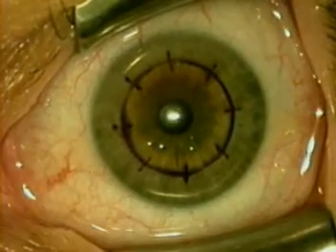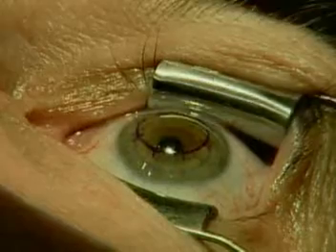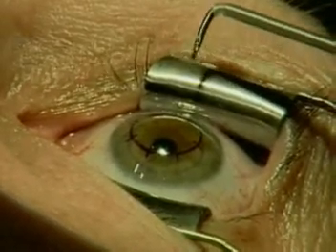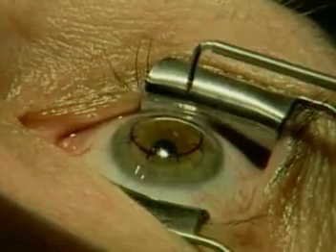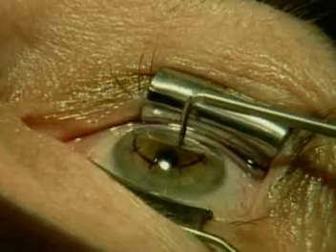The outer hash mark is at eight millimeters. We make sure that the hydration of the cornea is uniform — that's why you saw the irrigation followed by the drying of the fornices. The keratoplast tip is then prepared for insertion.